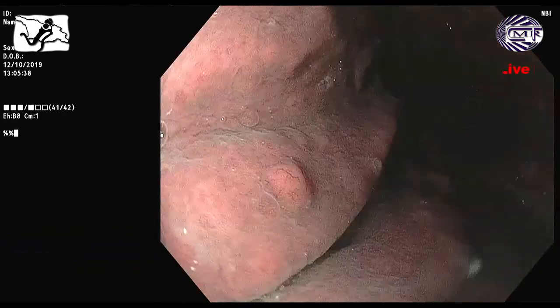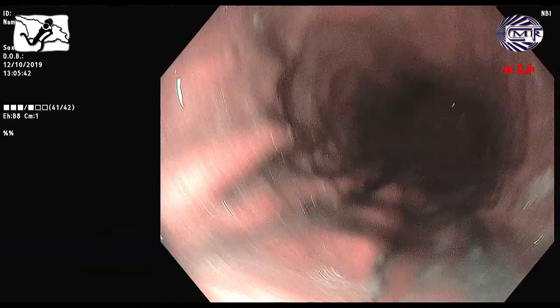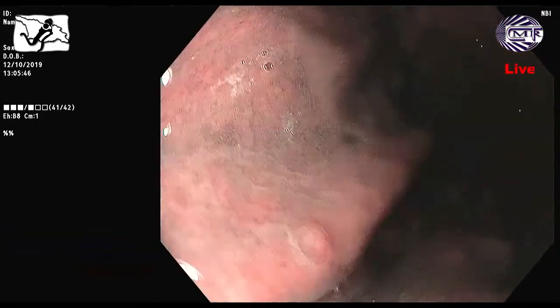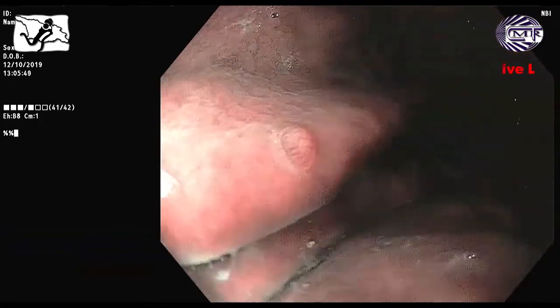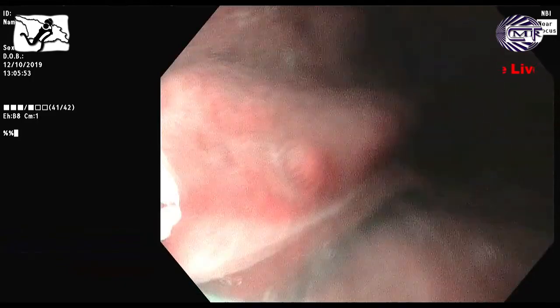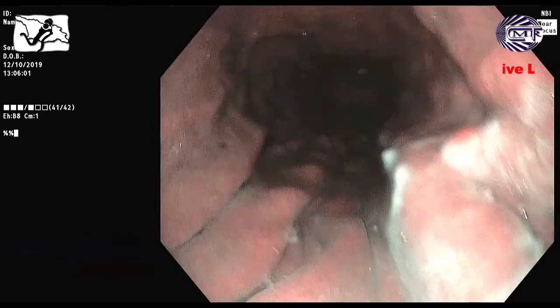Okay, this is. We need the biopsy. Do you want a biopsy? Yes. No. No. It needs absolutely benign, right? No. The gastric surface pattern is regular, not irregular, and no tumor vessels. This is the foveolar hyperplasia, right? And then, just a moment.